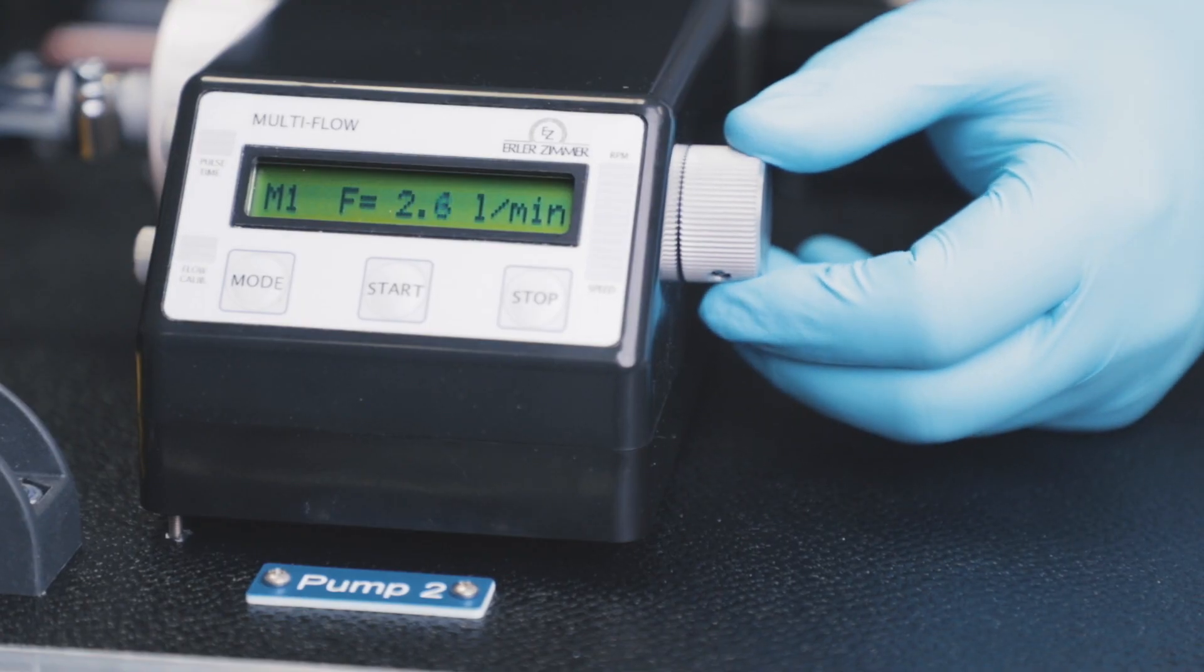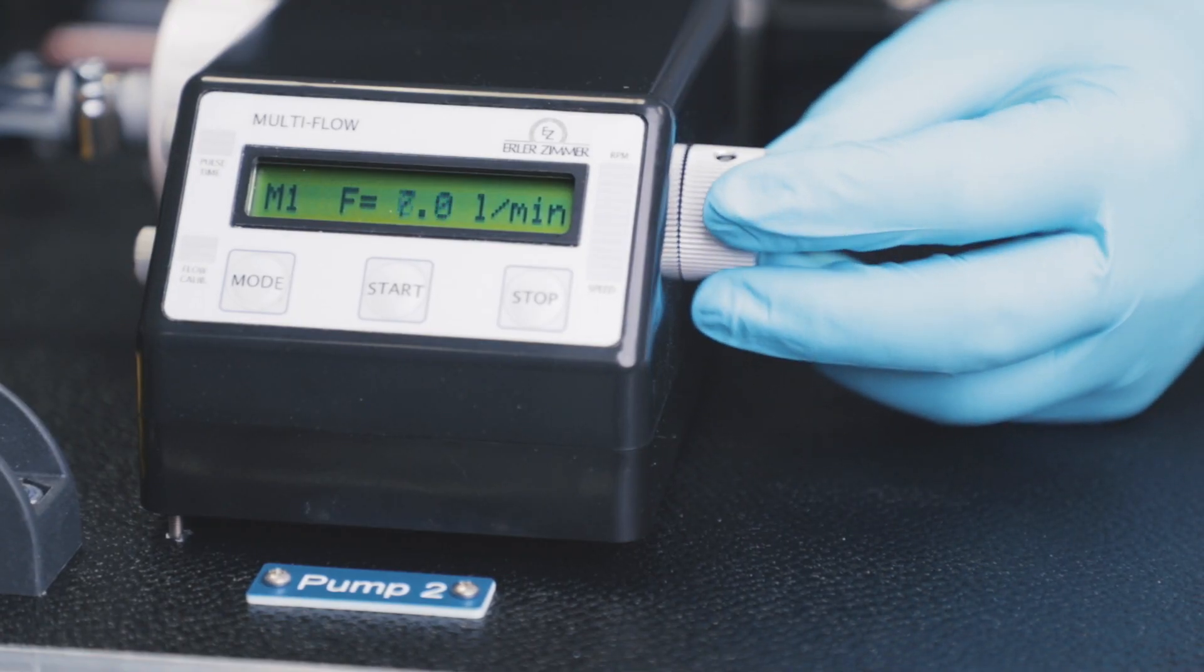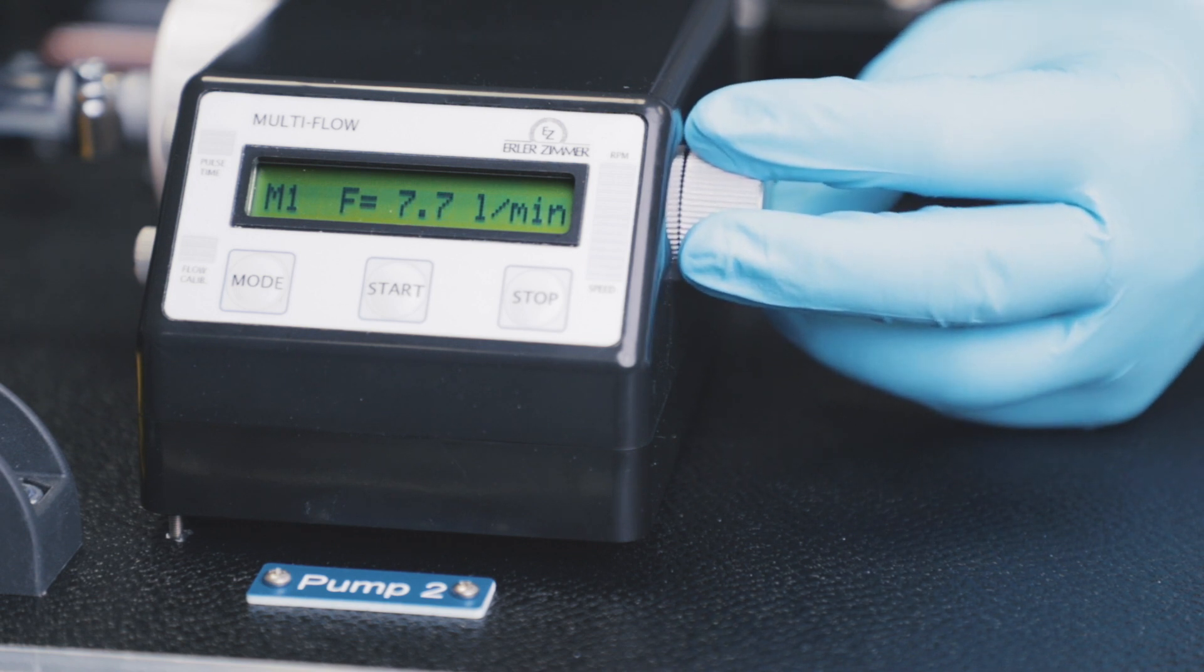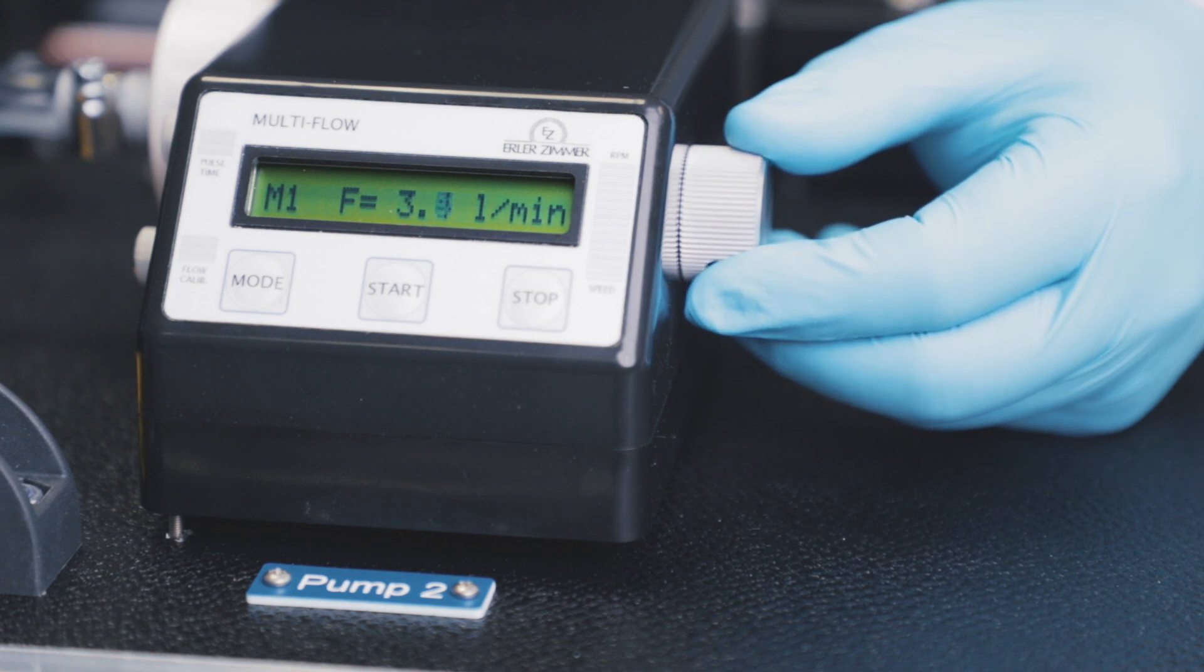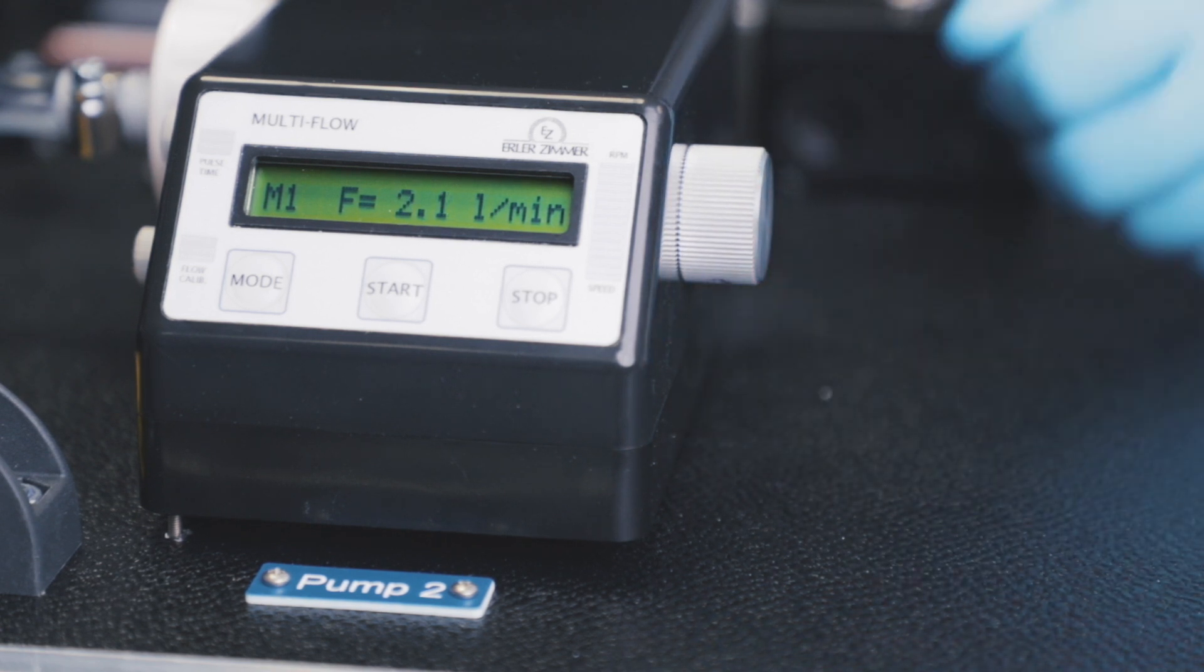The pumps have a big knob to adjust the volume of blood that is pumped. The display of the Venus pump can be adjusted. This pump is operated in mode one, showing the blood volume in liters per minute.